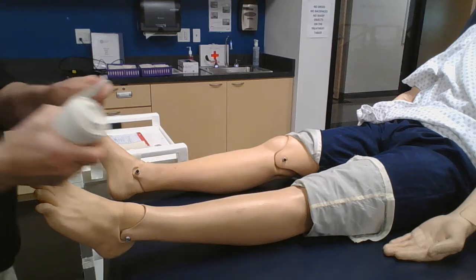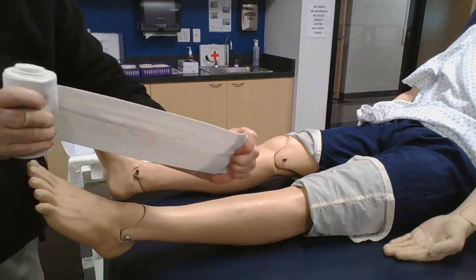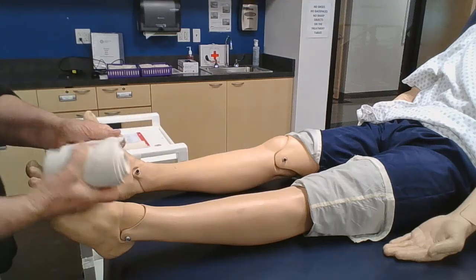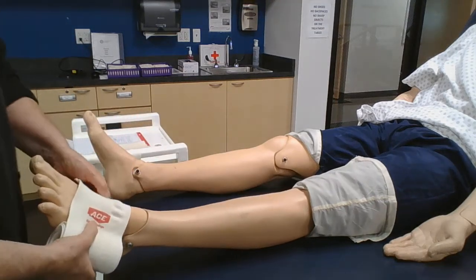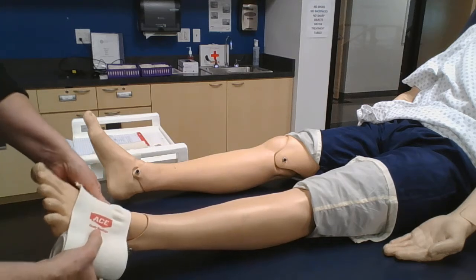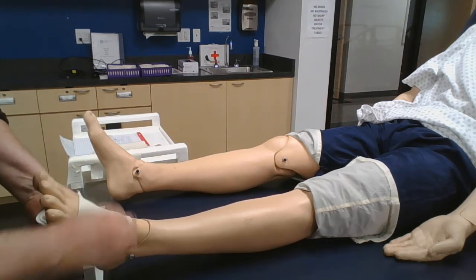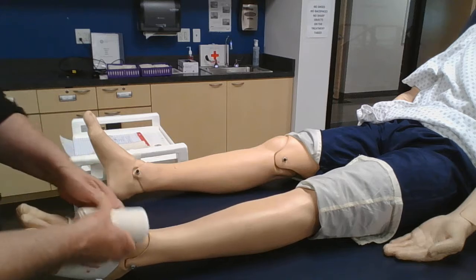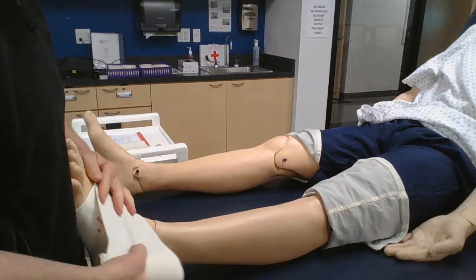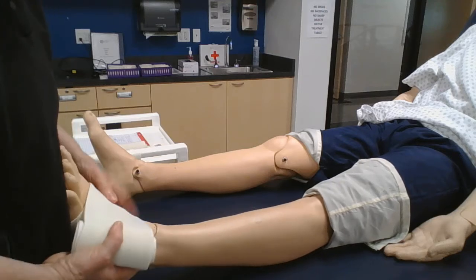Okay, so let's get a different one. A little tighter. So again, remember, you guys, we have our full stretch, 50% stretch, zero stretch. So we're going to start, and we're going to anchor this. I'm going to anchor this. While I anchor it, I'm not so worried about the dorsiflexion. Now I'm going to start thinking about the dorsiflexion. I've added a lot of stretch down here.